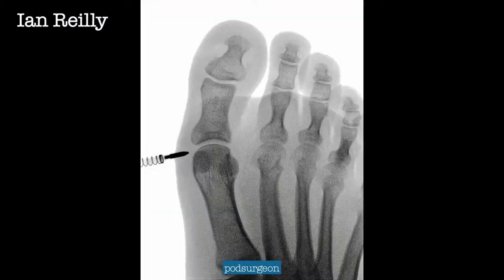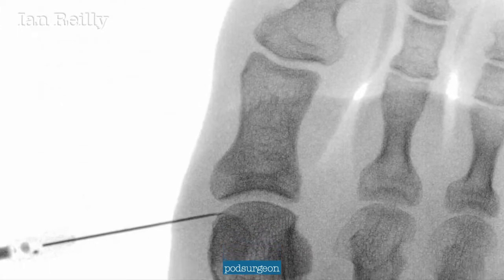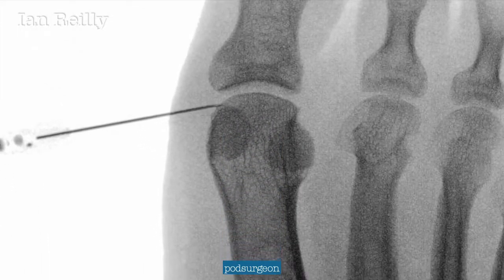I've used a radio-opaque marker to point out where I think I'm going to put the needle to get into the joint. This particular radio-opaque marker is very useful because you can also write with it — you can get them from America for about $200. We've palpated the joint, then done a skin prep, and then marked up the joint — you want to do it in that order. Then we're going to advance the needle into the skin and take another baseline X-ray.